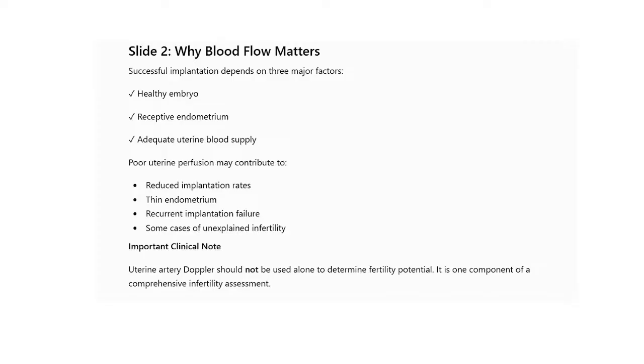So, important clinical note: uterine artery Doppler should not be used alone to determine fertility potential. It is one component of a comprehensive infertility assessment.